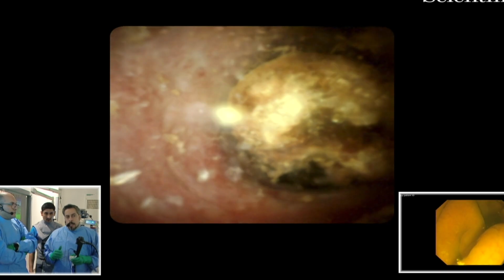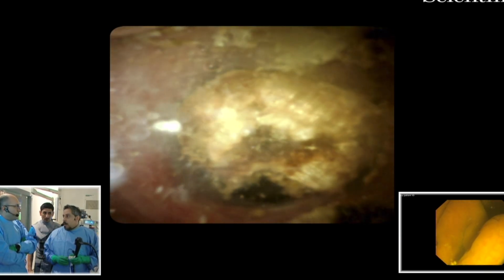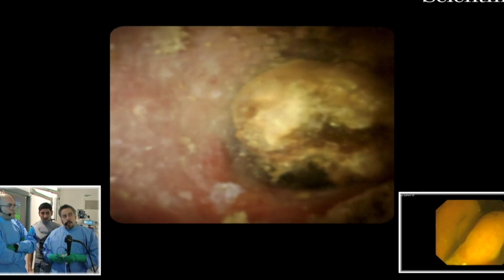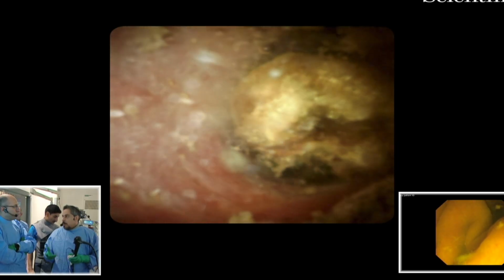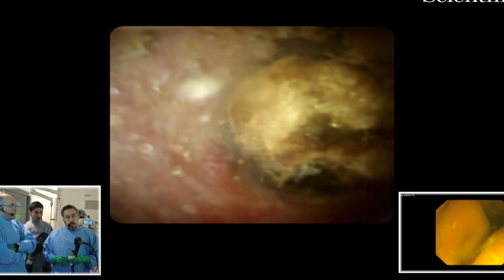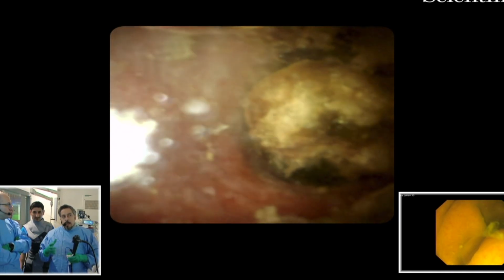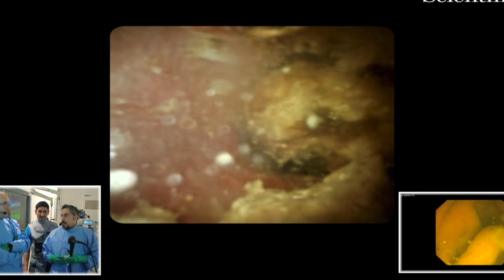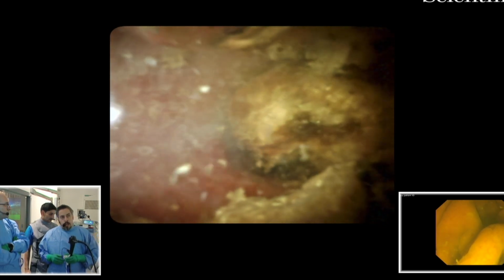So you have to combine visual impression with the tissue biopsy. And if I am suspecting a malignant structure, I usually take at least 8 biopsy samples to confirm. I agree. You're already in, so you can just take biopsies and prove it. We use the Monaco features for differentiating malignant and benign structure. If you see a clear mass lesion, then this is very highly suggestive of malignancy. But again, you really have to combine this with biopsy.